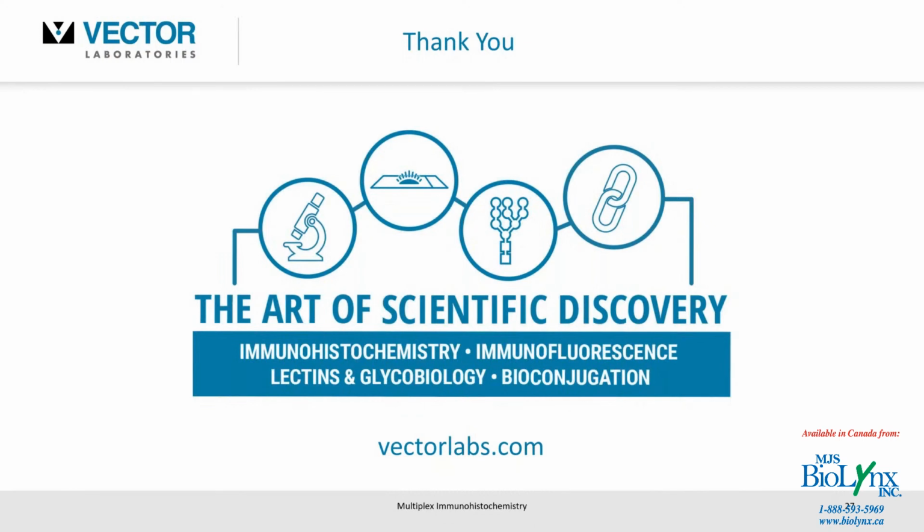So there's a couple of ways you could target that. Try them with the higher pH, more of a universal marker. If that doesn't work, do them separately with a heat-resistant substrate, such as DAB, as the first label, for example. Okay, great. The next question is, what is the maximum number of enzyme substrates that I can use in multiplex IHC?